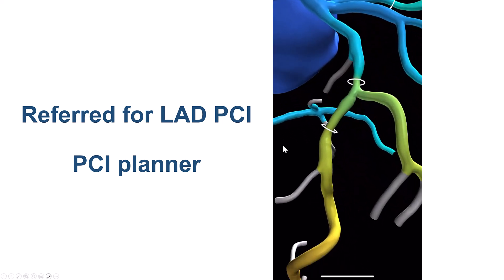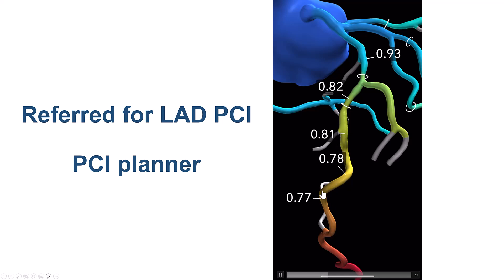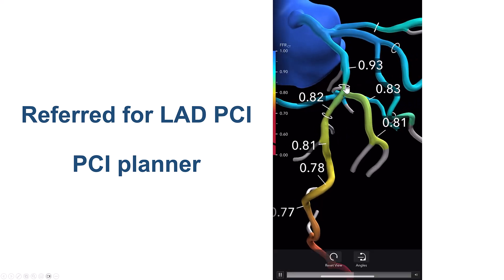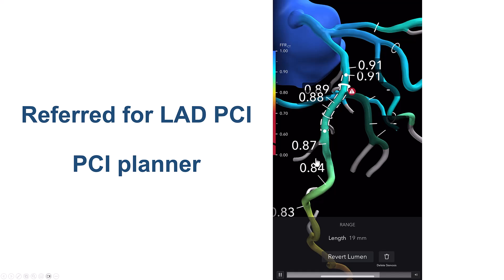One of the ways to plan PCI is to use the PCI planner, in which the FFR-CT values are plotted against the vessel, and then by pressing into the circles one can virtually place a stent and determine the length of the stent and see what the post-PCI physiology will be. What we're seeing here is the post-PCI FFR distal to the stent is going to be 0.87, and the same for the diagonal branch.